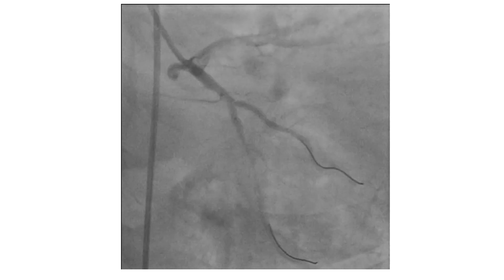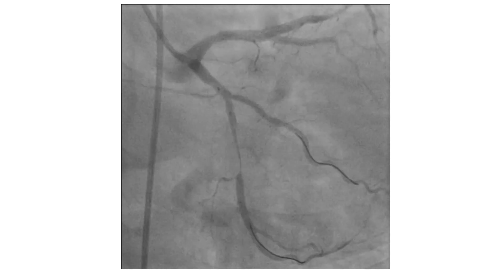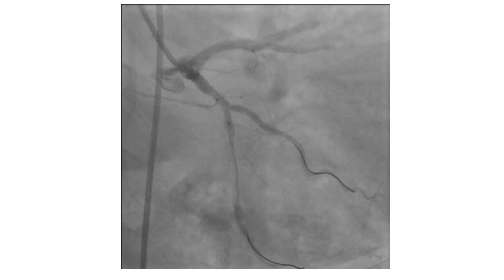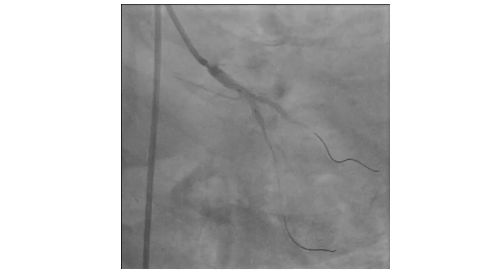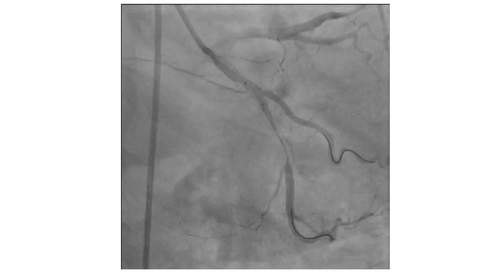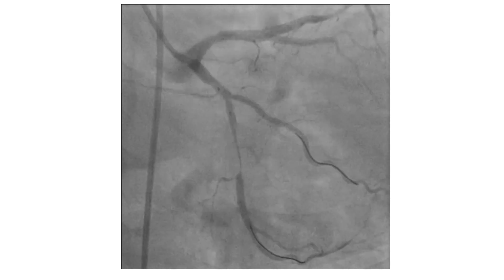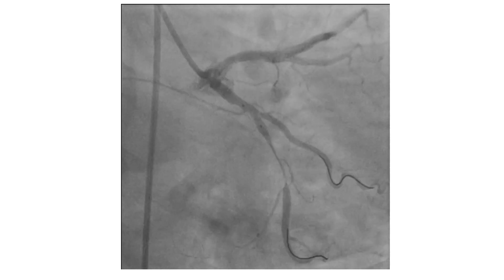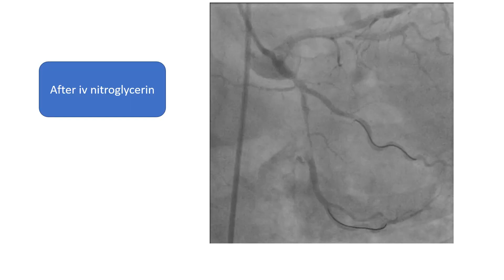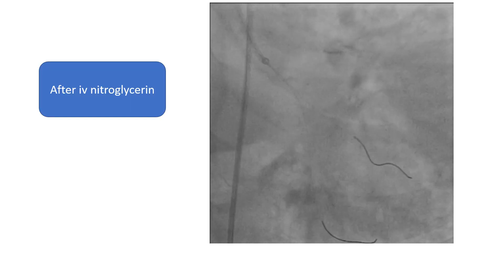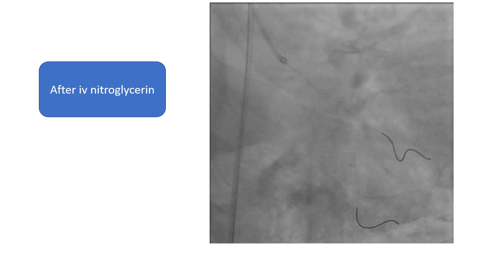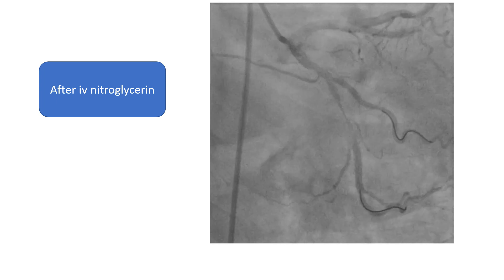This is the result after balloon dilatation. There is a clear tight stenosis away from and distal to the lesion. The first thing that comes to mind is spasm, since the outline looks smooth. IV nitroglycerin was given, but the result remained the same. We needed intracoronary imaging, and IVUS was done.